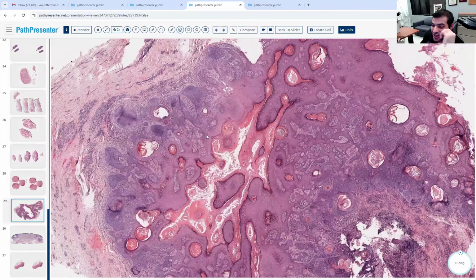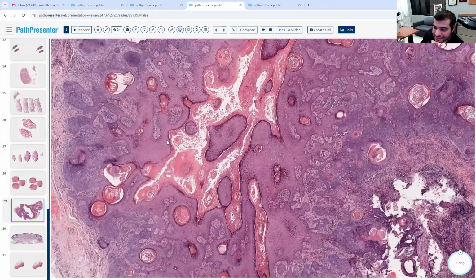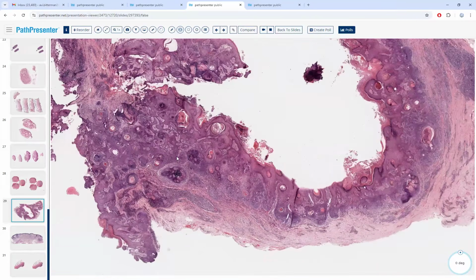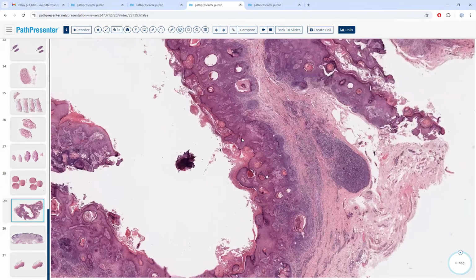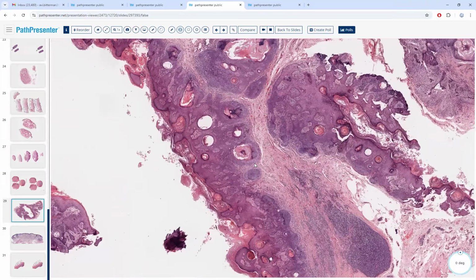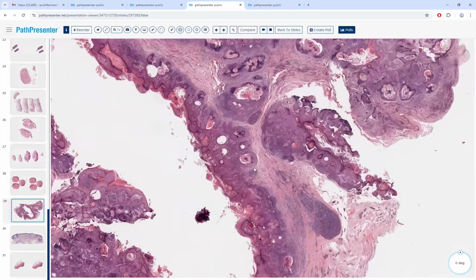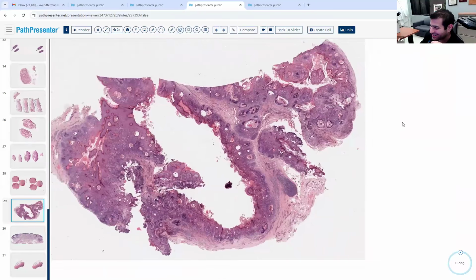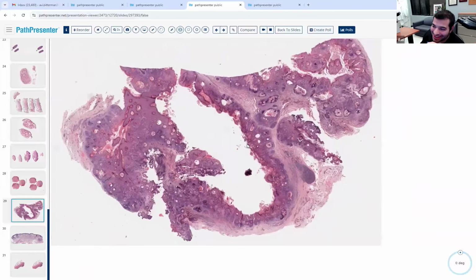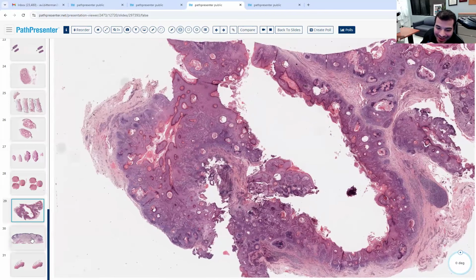So what tumor differentiates toward all portions of the hair? Is that panfollicular? I don't remember the name. Panfolliculoma. You got it. We got there. Okay. Yes, this is a panfolliculoma. So yes, it differentiates towards all the different parts of the hair follicle.